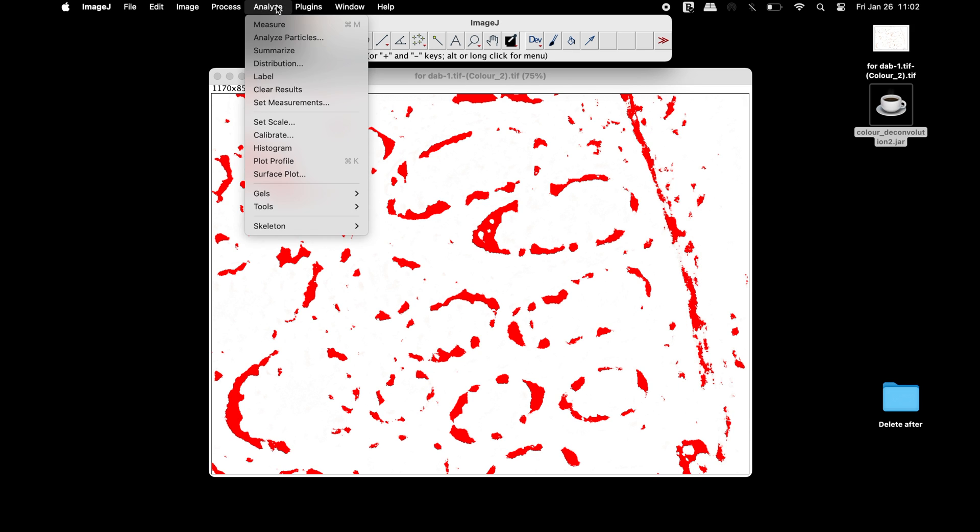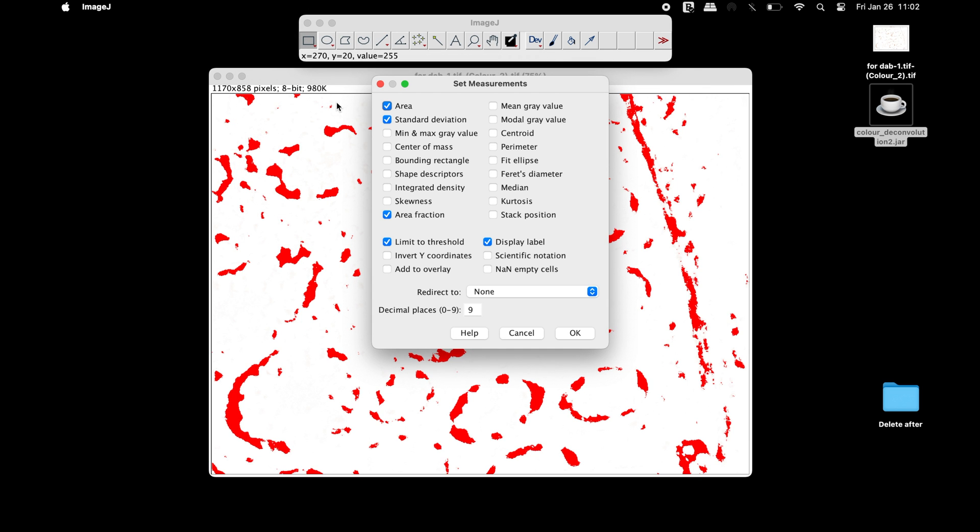Next, head to Analyze and select Set Measurement. In the Set Measurements window, select all the parameters that are required for the quantification, such as area, standard deviation, area fraction, limit to threshold, and display label. Once all the parameters are set, click OK.